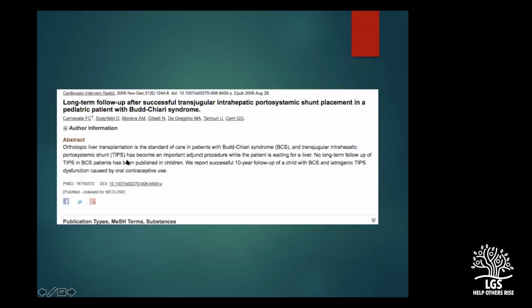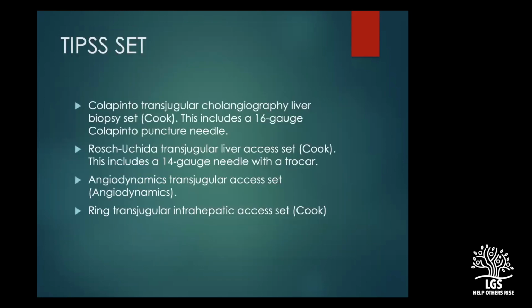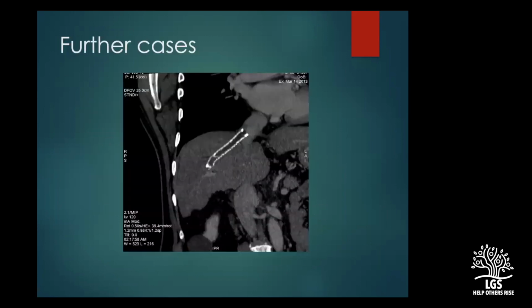So again, the other scenario wherein we offer TIPS is in the context of Budd-Chiari syndrome. So this is one particular paper wherein they did a long-term follow-up study after successful TIPS placement in a pediatric patient with Budd-Chiari syndrome, and we had one such case which I will be showing very shortly. I'll skip this. I don't want to go into the details of the TIPS set. I suppose this is for interventional radiologists.